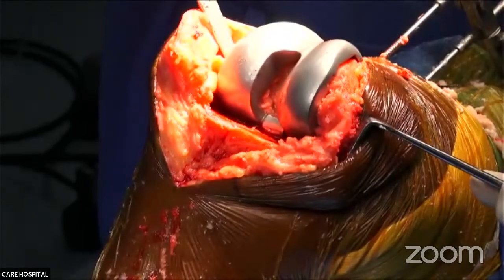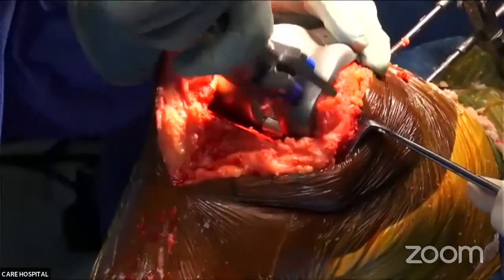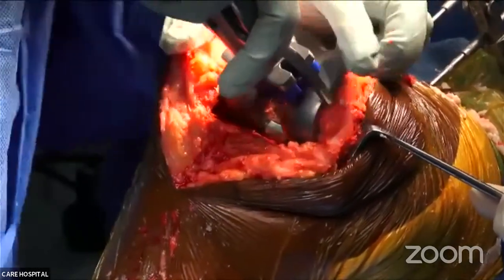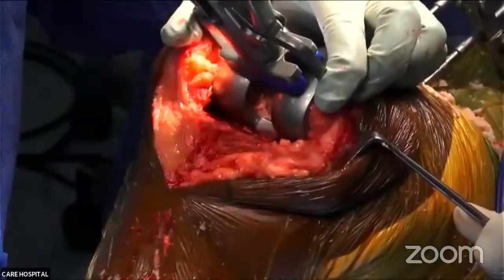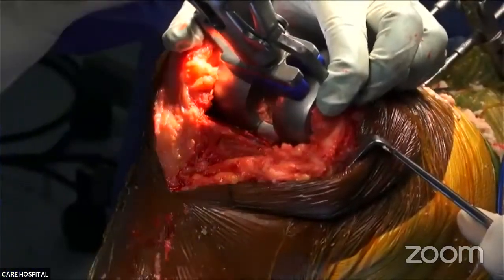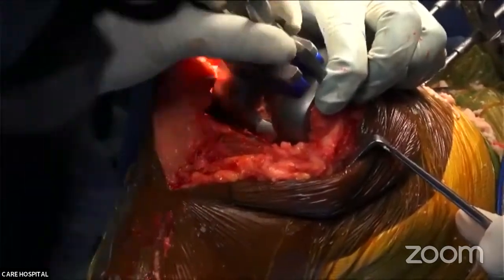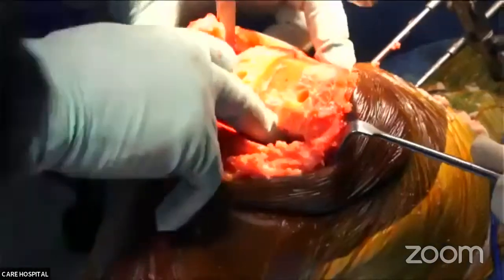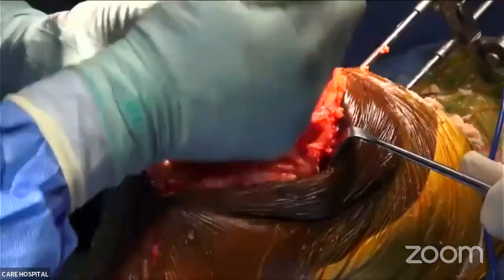Stem. Handle. Central here. Here another. Keep it there.